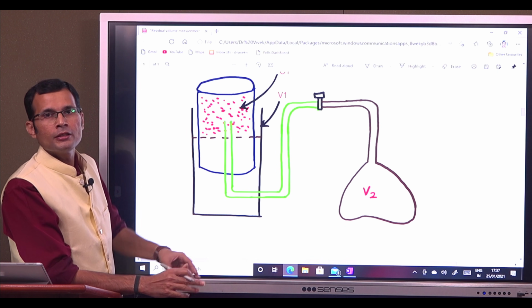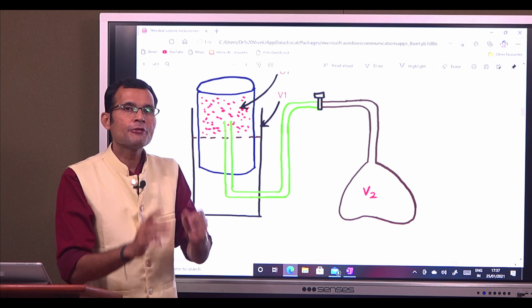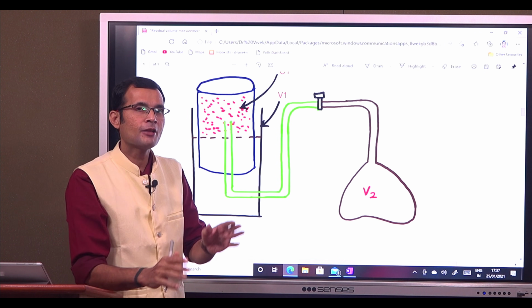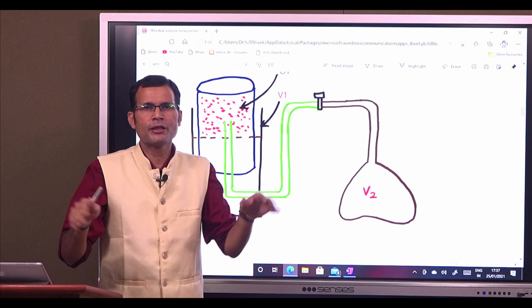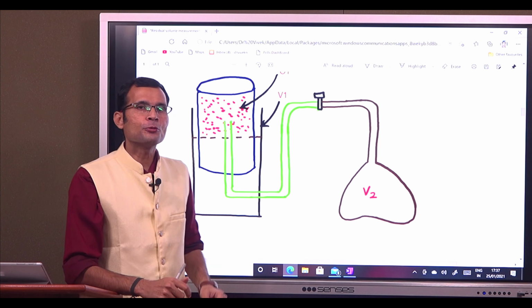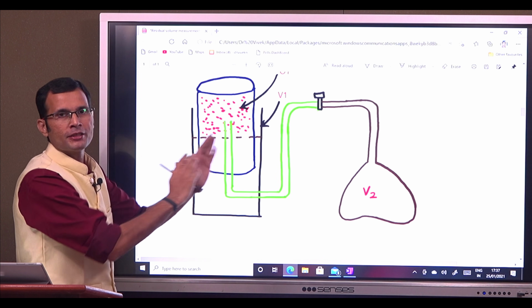C2 and V2, if you understand that, you have understood the method. So please understand what is C2V2. C1V1 is equal to C2V2, that's very basic, you know the formula already. What is C2 and V2? You must understand that. So listen to the method.